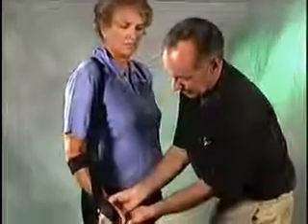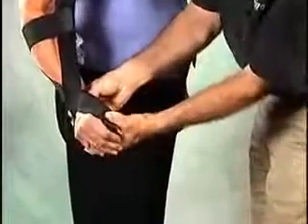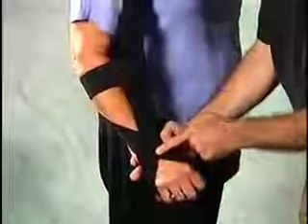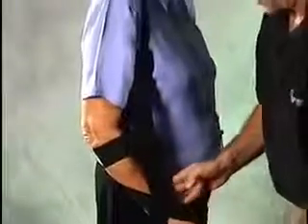Now, in fitting the handle, you want to make sure that the handle, which is oval in cross-section, is fit snugly up into the web space between the thumb and the first finger. The cross should be over the dorsal surface of the wrist, and the elbow strap should be about an inch to two inches distal to the olecranon.